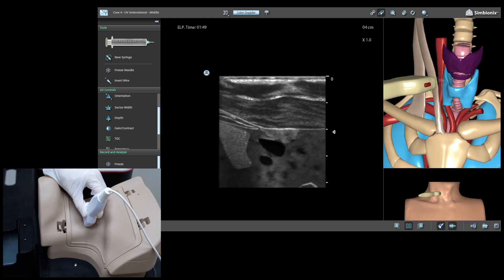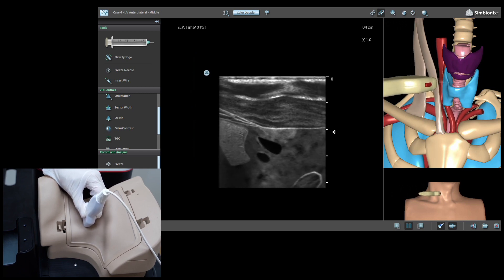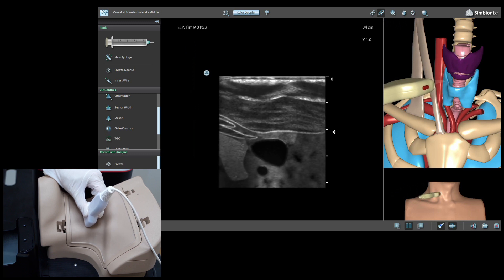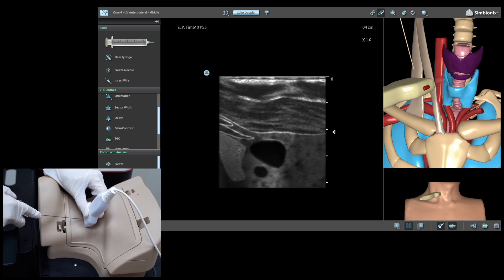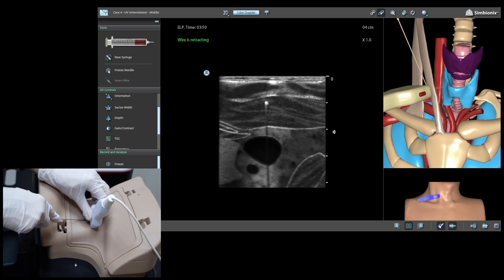For the next step, we will choose the needle puncture location. For the out-of-plane approach, we will place the linear probe in short axis and adjust the internal jugular vein to be at the center of the ultrasound image in the triangle region formed by the sternocleidomastoid muscle.